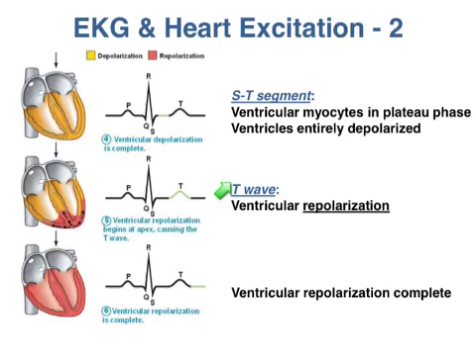If you have coronary artery disease, you have impaired blood flow to the myocardium, impaired oxygen to the myocardium, and you can get disruption of these features. Myocardial infarction, heart attack, can disturb both the QRS complex and the ST segment and T wave. But looking specifically at the ST segment and the T wave can allow a cardiologist to distinguish between an old infarction, damage that might be weeks or even years old, and an acute, ongoing event that needs to be treated.